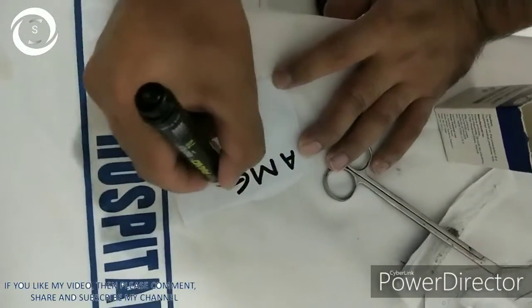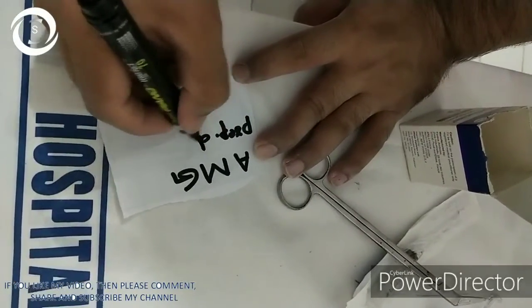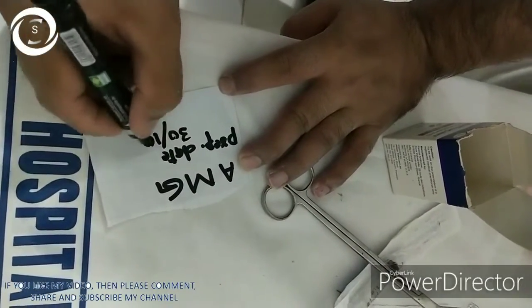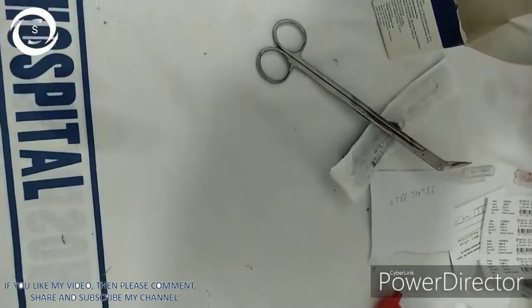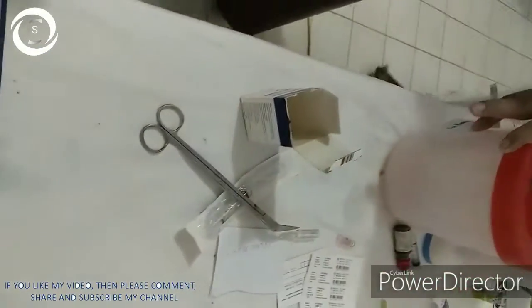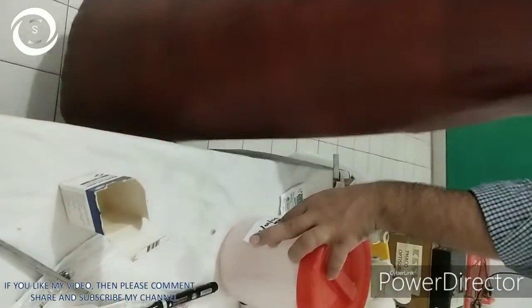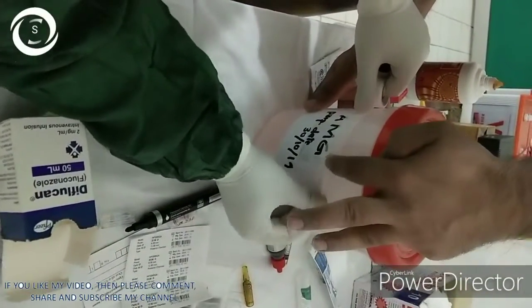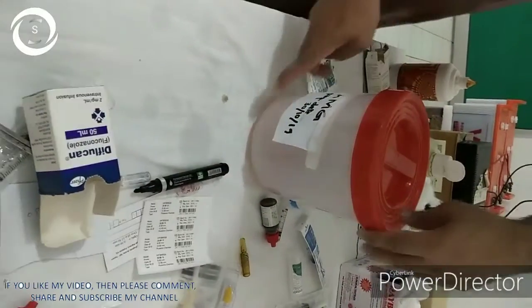When you prepare it, you should label it and write the preparation date — for example, prepared on 30th October 2019. It is then ready for use. In most developing countries, we use freshly prepared amniotic membrane graft within a week for different ocular procedures.